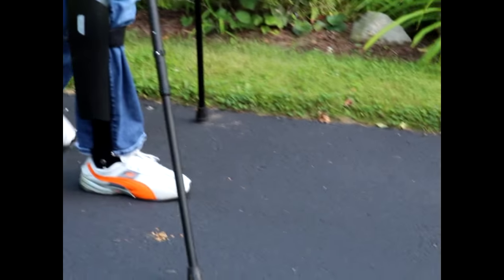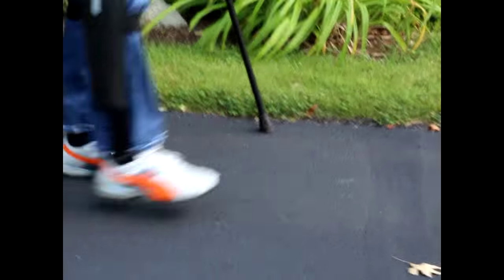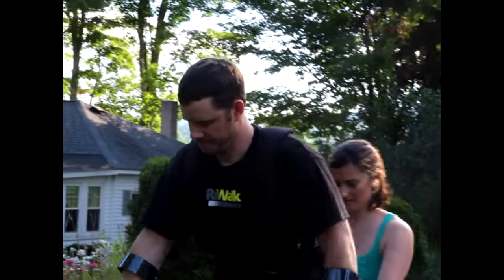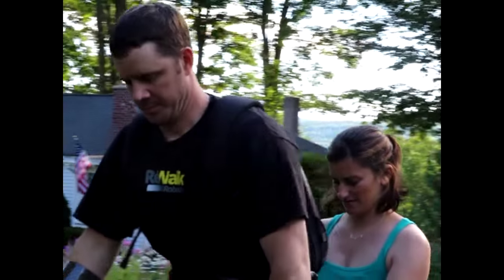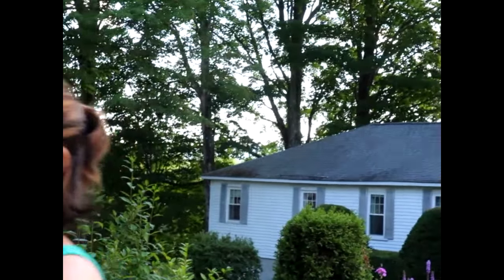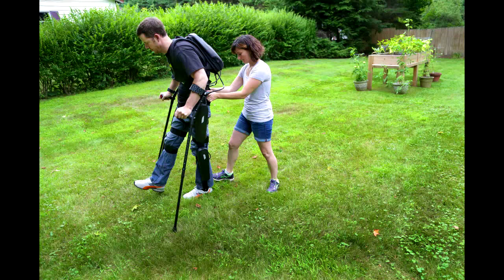I wouldn't necessarily say that the ReWalk is any different in working with Colleen. I think it's just another challenge, because she's sort of been my rock since the start of this. So we've learned how to maneuver through life's challenges together. It's pretty emotional at first — to see him upright is a pretty big deal. And just to see how happy he is is very, very exciting.